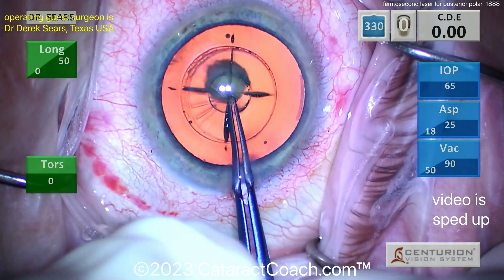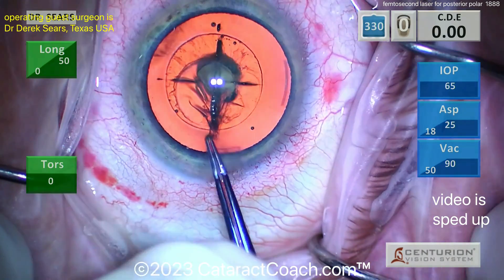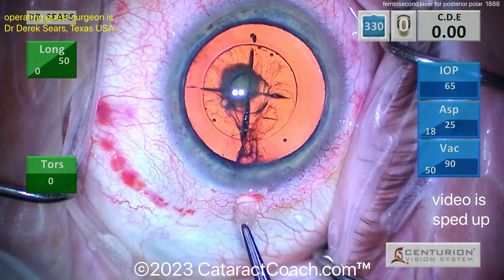Here is that capsulotomy — look, it's not free floating. You've got to grab it, and look at that little shake that was just performed. That's to make sure there are no attachment points. Beautifully done — get that out of the eye.